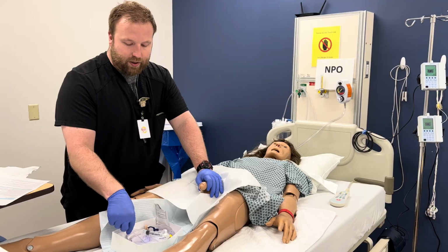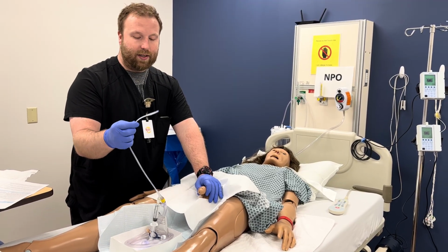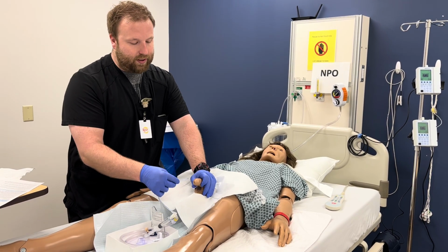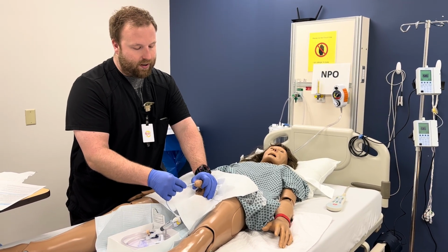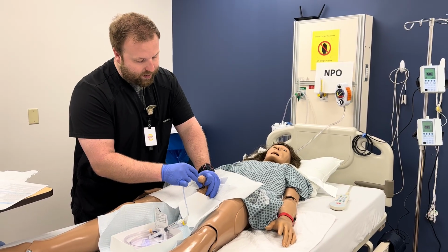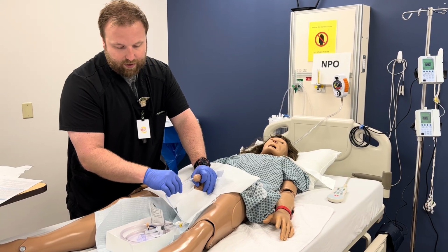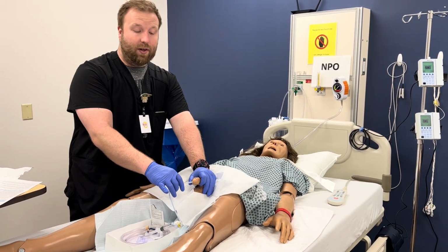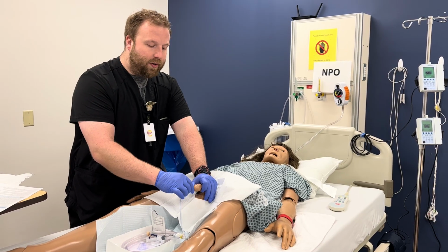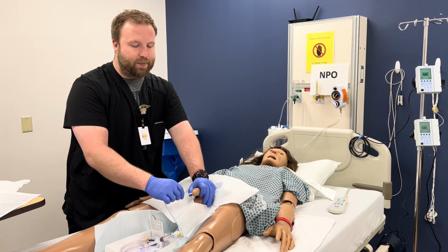I want to grab my catheter here. It's already got lubricant on the tip, and I want to insert this into the penis. It may not fit. Yep. I am going to insert this. It's not going to fit right now, but until I see urine, you'll see urine flow into this tube here. Once I see that, I'm going to advance the catheter 1 to 2 more inches.